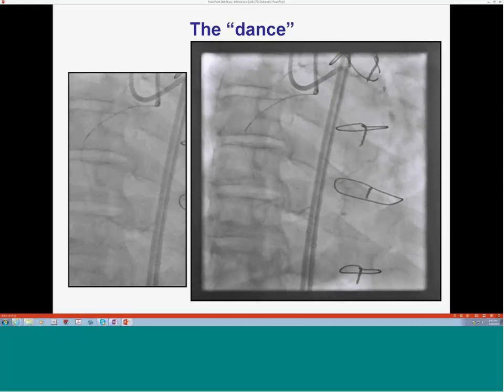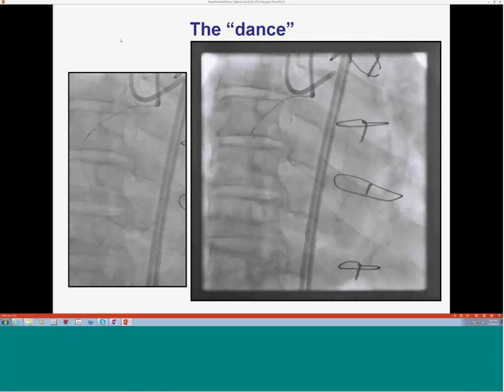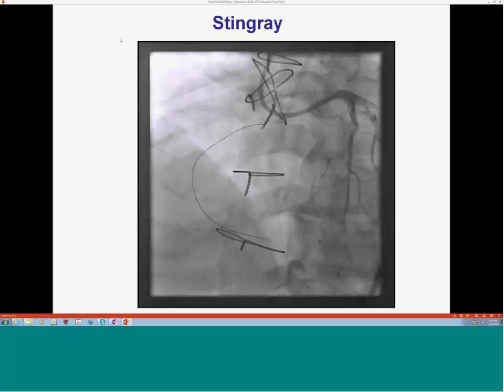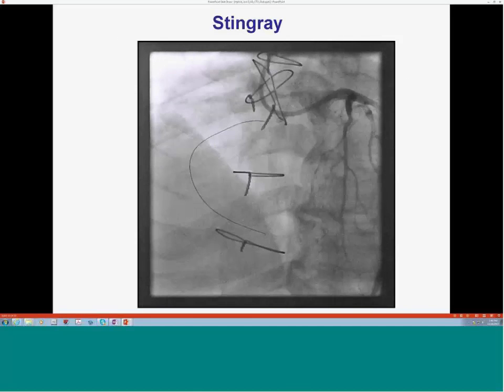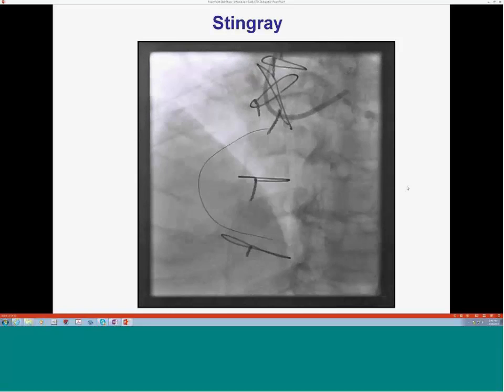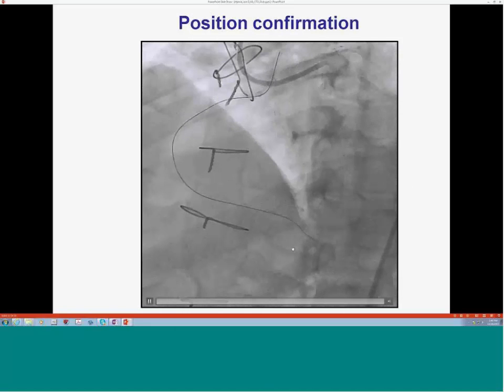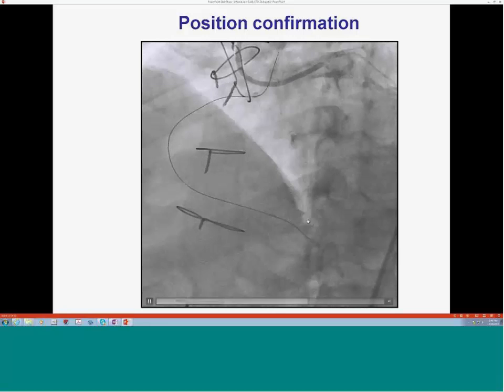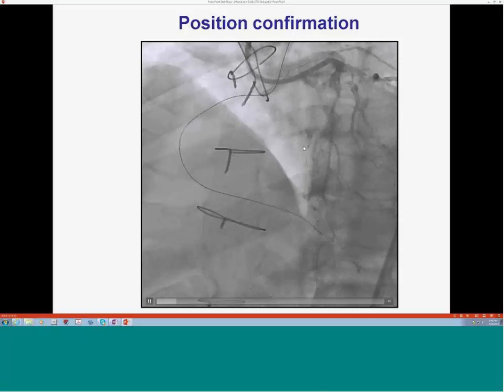And unlike the other case, if you can see the movie now, the knuckle is moving nicely next to the vessel wall with a contralateral injection. So it looks like we're in a nice location. And this is the re-entry spot, Stingray wire. You can see we're on the railroad. Probably it's hard to see on the other monitors. This is very, very small. But we're able to get through into the distal right and confirm. You actually see a little bit of stain in the septum. That's from the failed retrograde attempts.